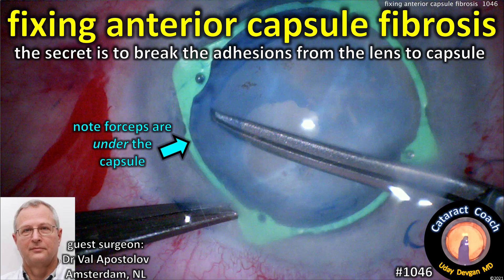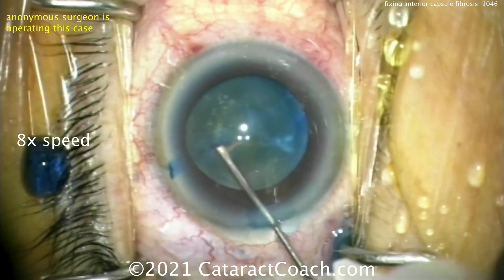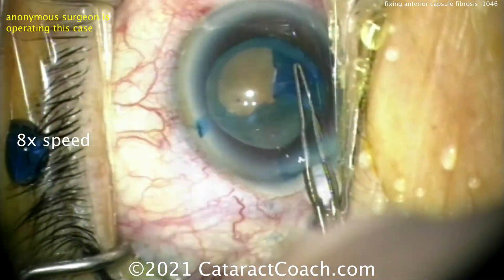CataractCoach.com: fixing anterior capsule fibrosis. The secret is to break the adhesions from the lens to the capsule, starting centrally. Here's a typical case we see of this.